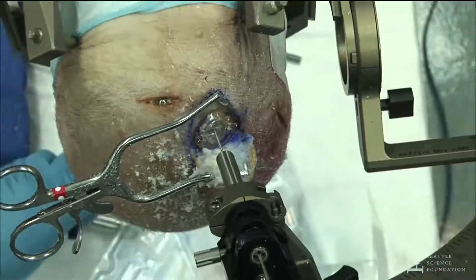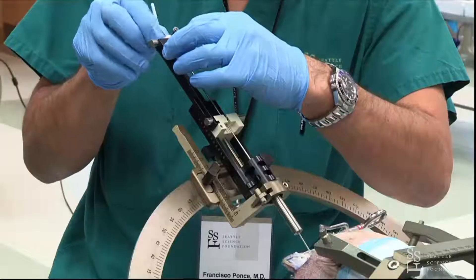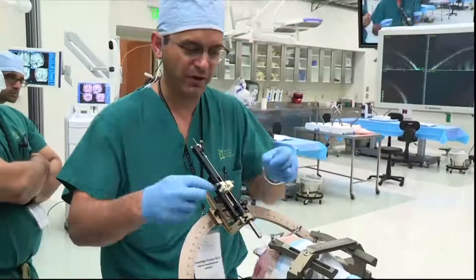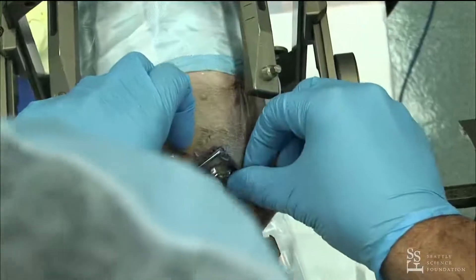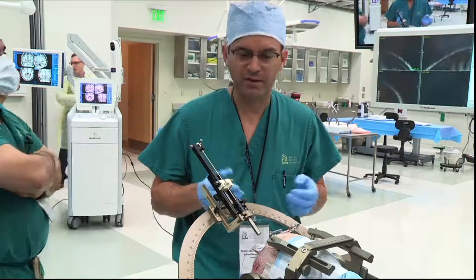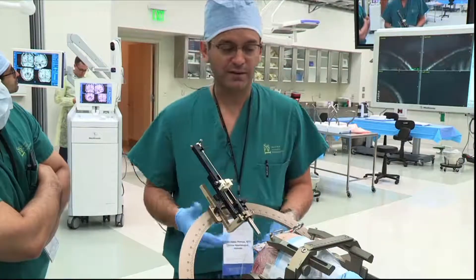We put our little clip, mark it, and call for CT — and we're going to skip that step. But then we scrub out and verify on our MRI that we had our target. Once we know that, we'll take out the stylet, making sure we don't injure the circuit. I always tell all my scrubs: do not touch my hardware. I peel the device open — we don't have the device sitting open on the field while we operate; it's only when we need it. We switch gloves before we're ready to handle the internal pulse generator. Then usual steps for closure. With the flap and countersinking, we really haven't seen post-operative wound issues. I'll pour some vancomycin powder into the pocket that we tunnel posteriorly — about 500 milligrams for the stage as well. That's our pixie dust. And that's how we do our lead placements.